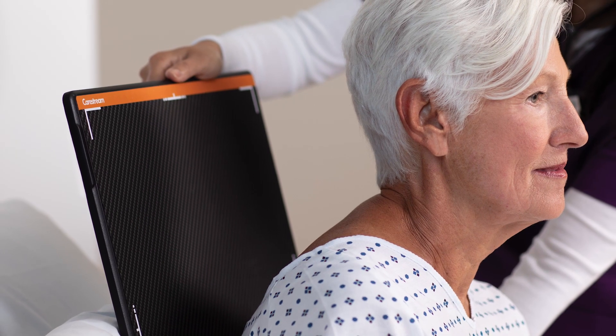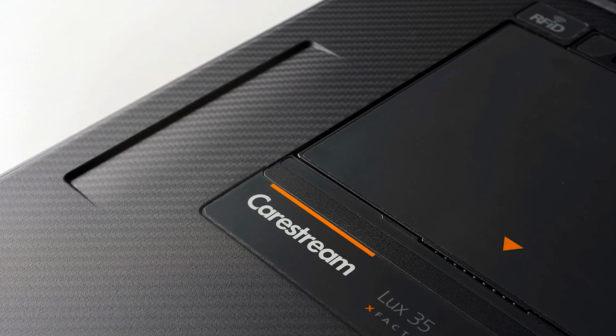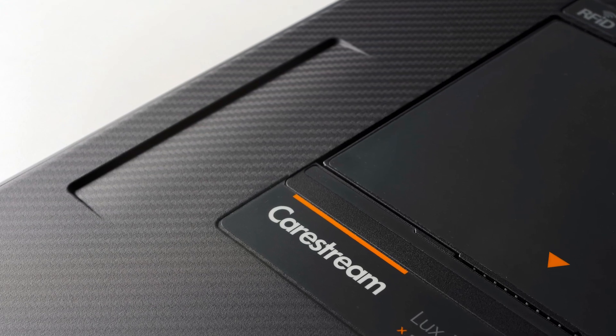Rounded edges slide easily behind or under a patient, reducing discomfort. Built-in finger grips help reduce tech fatigue, especially when doing mobile exams.